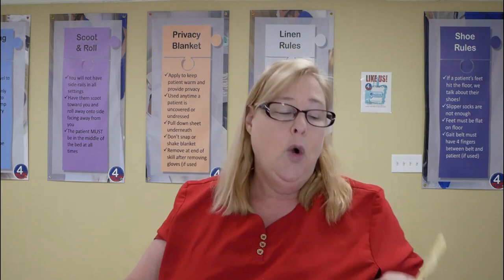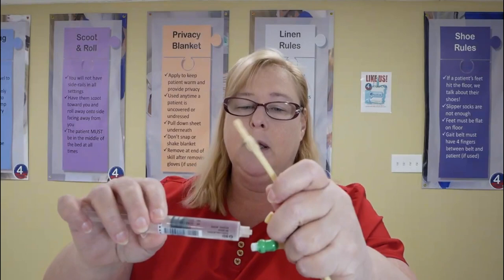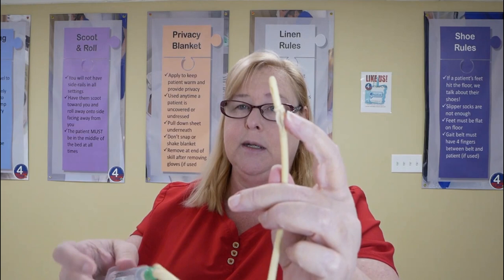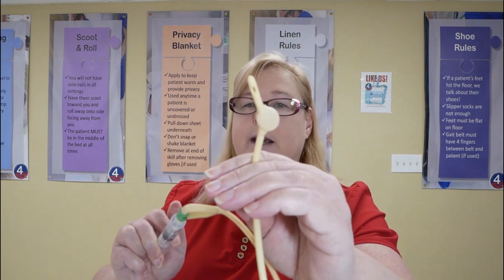Once we get that catheter in place, the nurse will take water, they put it through a port right here. This is a port, and all this does is let me fill up this balloon. It doesn't put anything inside the patient. Okay, so make sure it's on there. So I'm going to inject water here. You can see that little balloon fill up.